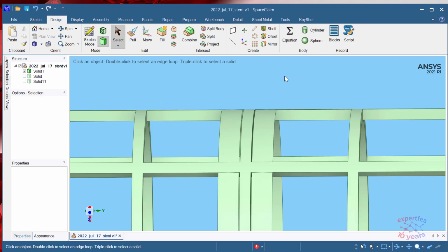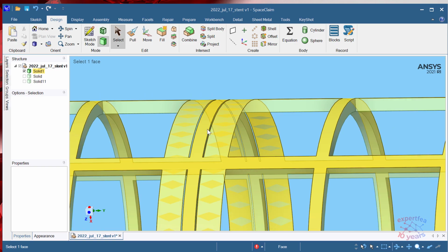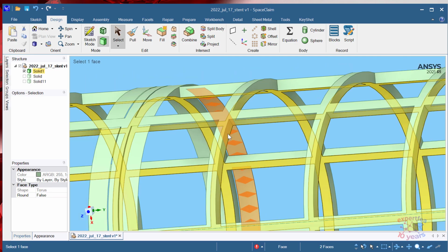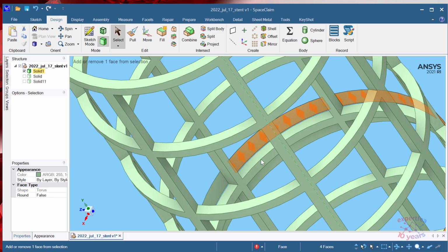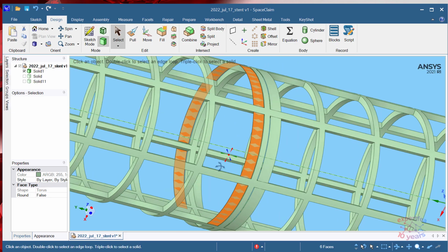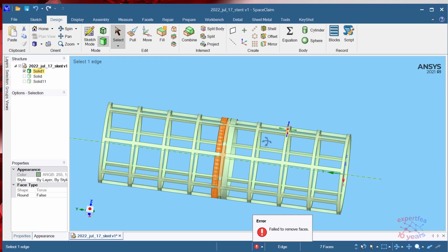You see, we only gained this face. I think it was stolen from the plaque. Let's select all these extra additional faces with Ctrl pressed and hit delete. See if we are in luck. We are not in luck.